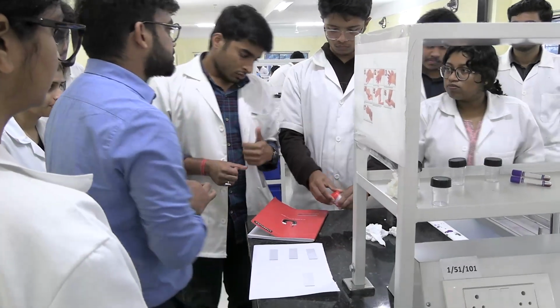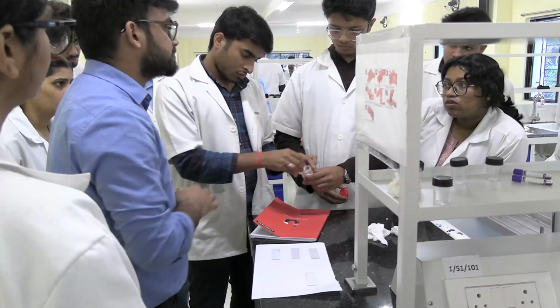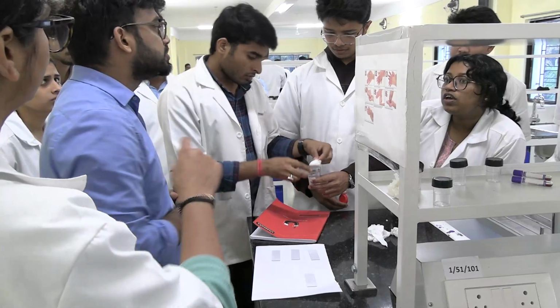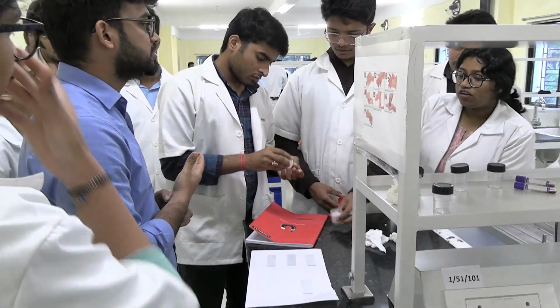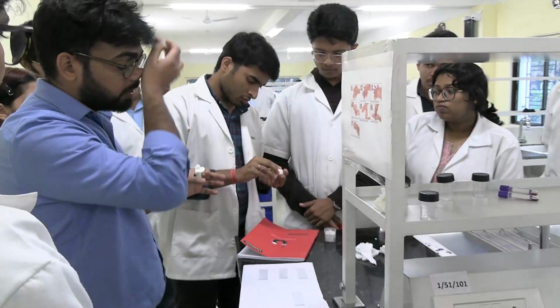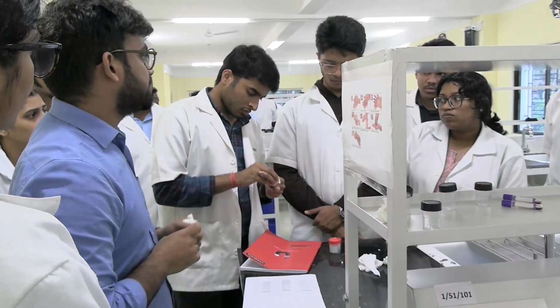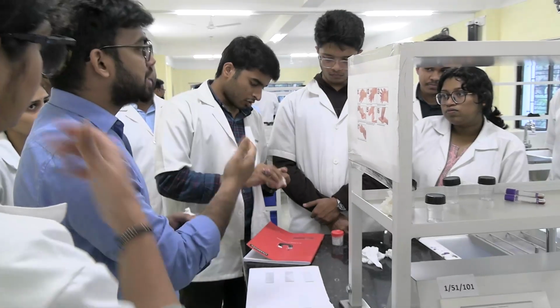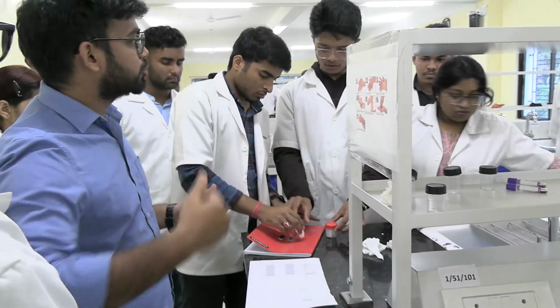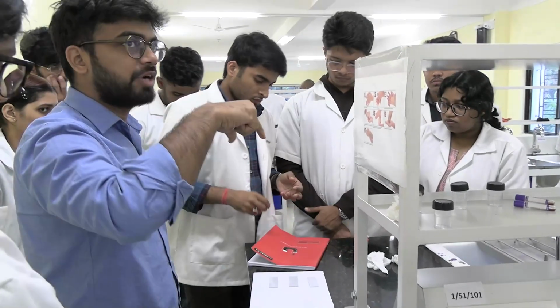What will happen if I make the angle of the spreader more than 45 degrees? Thicker, at the head end it will be thicker. And what will happen if the angle of the spreader is less than 45 degrees? Thinner at the head end, and the blood cells will be present more at the periphery. That's why you need to make sure the angle is 45 degrees.